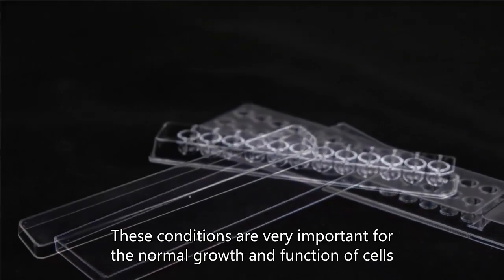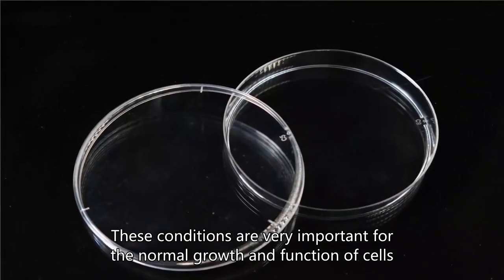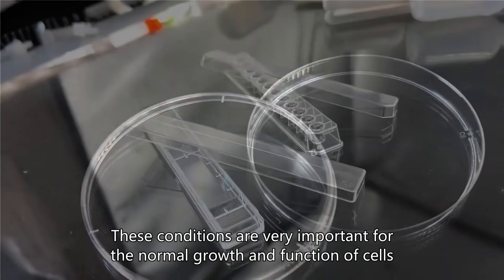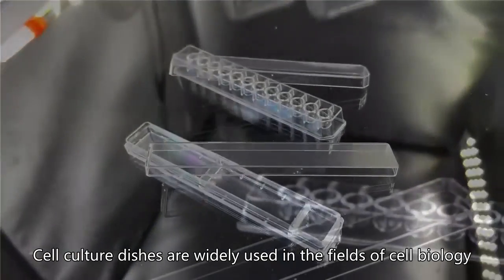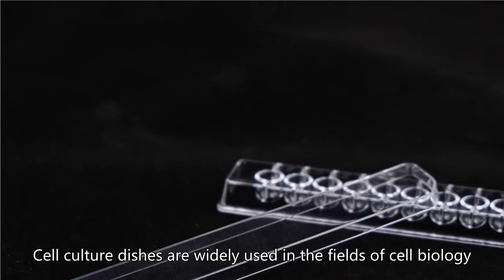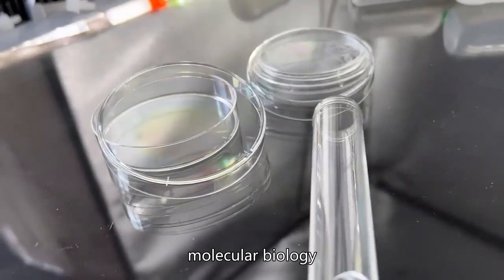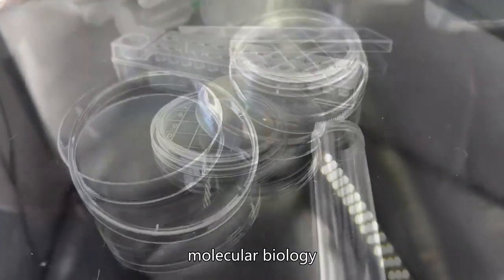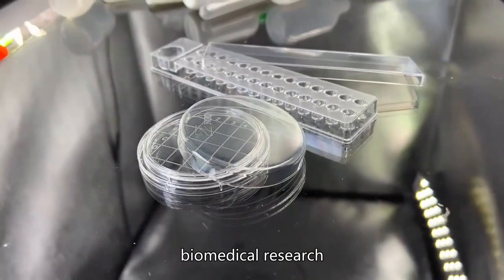These conditions are very important for the normal growth and function of cells. Cell culture dishes are widely used in the fields of cell biology, molecular biology, biomedical research, and drug development.